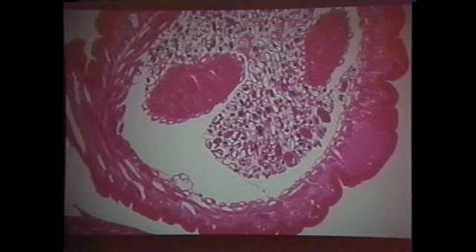Remember, the acanthocephalans have a proboscis. This is moved out hydrostatically by muscular kind of things that evert or invert the things. And these are the lemnisci right here. Look at these round little pipe-like muscles around it. And these push it out or in. Look at these muscles, how strange they are. Aren't these strange-looking muscles? You could never call this a nematode.